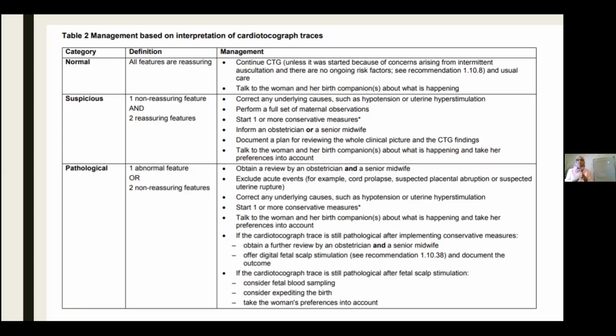Exactly like these numbers that we are very strict for you to tell us, 110 to 160, we have got very clear numbers for oxygenation levels of the baby that must be within the normal parameters. If they are not, stop the labor, deliver by emergency cesarean section. If they are normal, we carry on the CTG, we carry on with the labor. And if the CTG remains pathological after 30 minutes, you have to repeat the same process of taking the blood gas again. Does that answer that? Yeah.